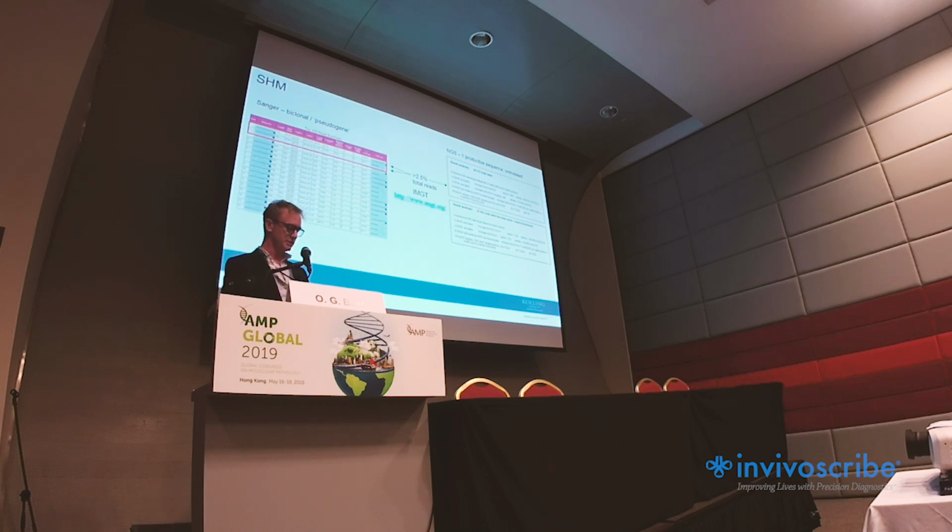In this particular case, you can see that by Sanger sequencing, the sample was deemed to be biclonal or have what's called a pseudogene. But by NGS, we identified the same two clones, but only one of them was productive, shown there at the top. That just highlights in one sample that NGS was more definitive in a way than the Sanger sequencing result.